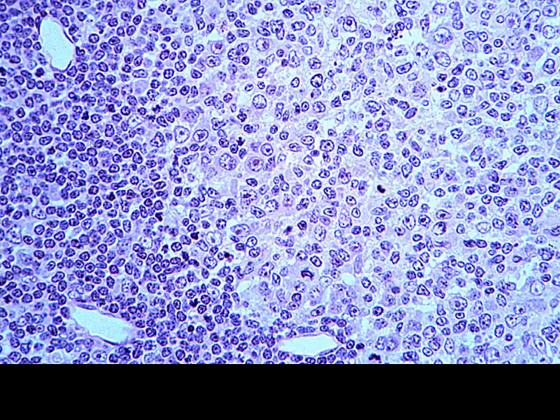Now, in this particular image, I believe we're taking a high mag look at a germinal center that we see here on the right. And this is going to be the outer, darker corona or mantle portion of our secondary lymph nodule. So we see a lot of lymphocytes. Some of the larger cells are going to be the antigen-presenting cells, macrophages, reticular dendritic cells.